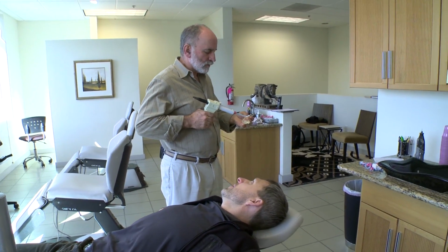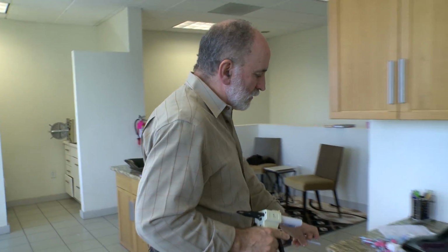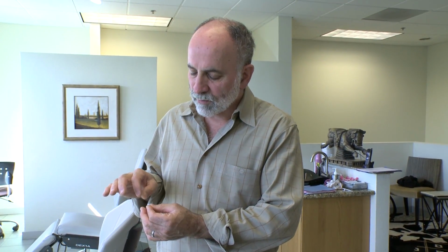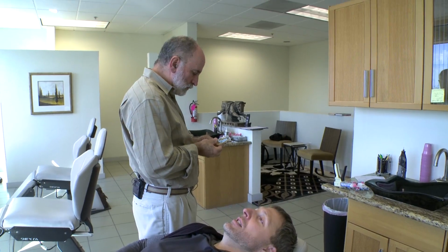One more time here. Yeah, using carbon paper doesn't work for this well at all. Carbon paper is just not nearly accurate or sensitive enough. This material is three-dimensional, so you can look through it and use it as a pressure gauge, much like putting an engine together. Carbon paper shows you where you hit, but it doesn't show you what part of the opposing tooth is causing the hitting. It's important to know not only where you're hitting on the bottom, but what part of the upper tooth is causing the hitting. And carbon paper is just not accurate enough for that, which is what most dentists use. Very close.